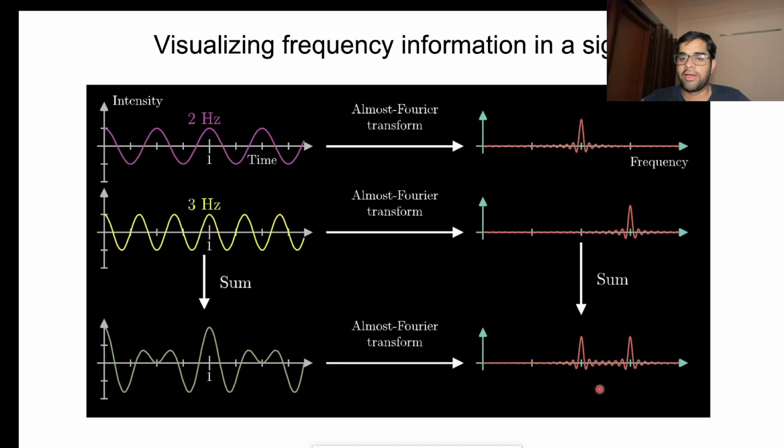So to make it clear what is happening, and also we have discussed neural oscillations, right? Neural oscillations are nothing but these kind of oscillations. You want to see whether it's theta or which band is prominent. For example, in a memory task, it is usually found that you see a theta oscillation going on when you're registering something in your memory.